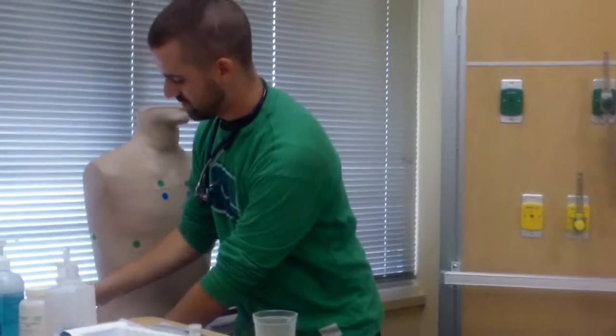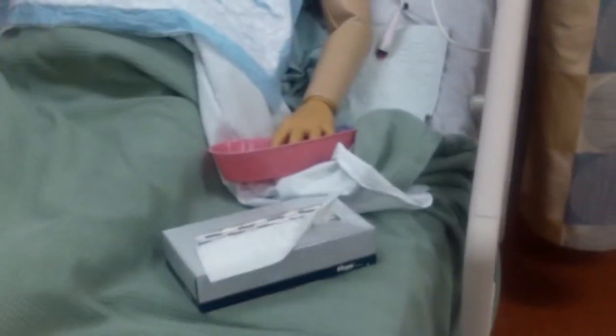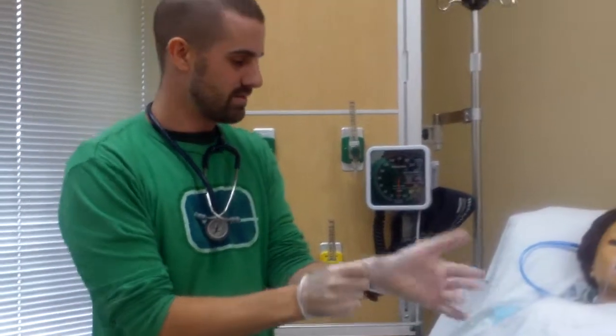So I'm just going to get on some new gloves. Okay. That's why I also provided some tissue. You can see that, tissue in the emesis basin, just in case they do decide to throw up. So I'm going to try to make this as painless as possible.